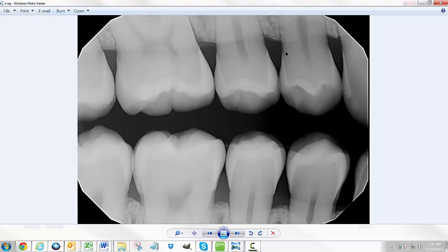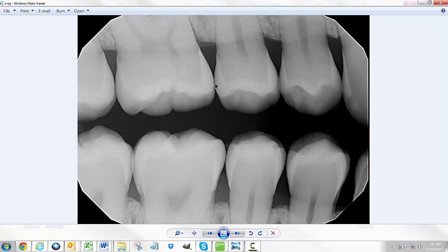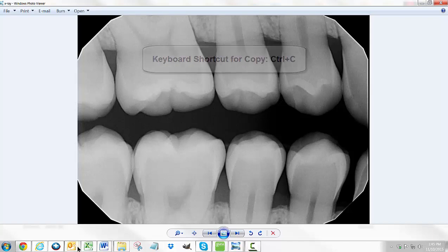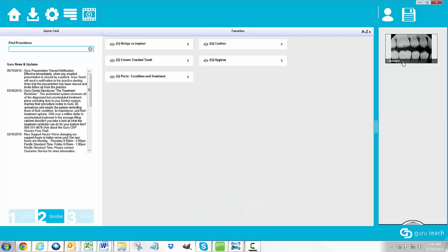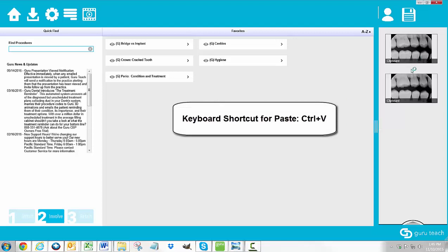If you are using a software that doesn't give you the option to copy when you right-click, your other option is to use the shortcut keys on your keyboard. The shortcut key for copying is Ctrl+C, and then you can go into the Guru Teach software and right-click and paste, or you can use the shortcut key for paste which is Ctrl+V, and that will also paste the image.